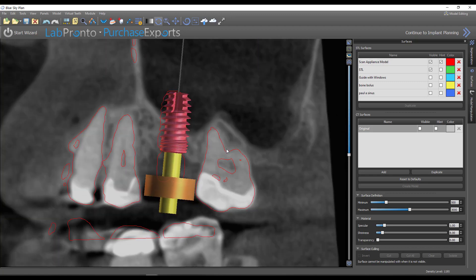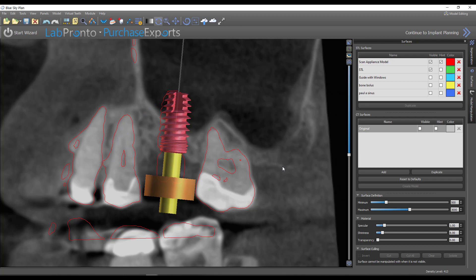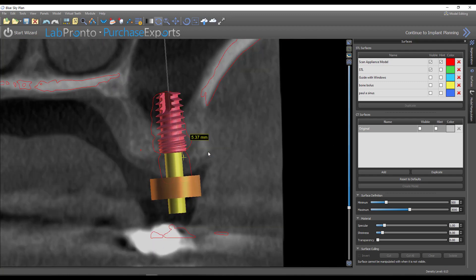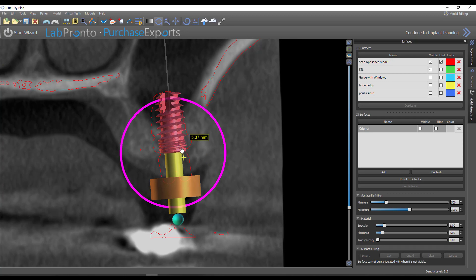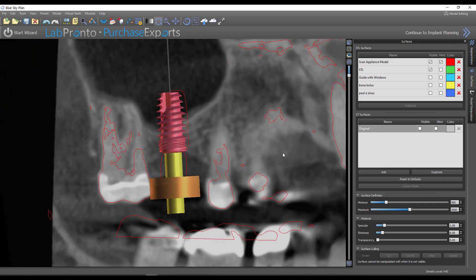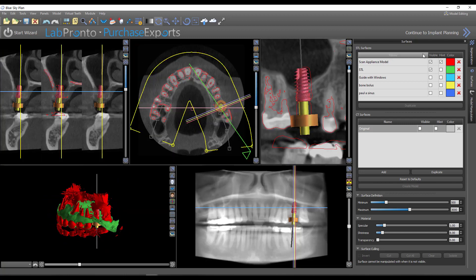So you can see depth is dead on. The positioning is a little bit towards the anterior by, you know, maybe half a millimeter. It's not even a full thread width. And you know, when you're doing these in a minimal amount of bone, it's always possible to lean on it one way or another and go slightly off course. But that's incredibly good. And then if we look at it from a mesial to distal view, you can see again that we are within the confines of that planned implant, maybe one or two degrees going more towards the nasal passages. But again, incredible amount of accuracy for the positioning of this implant. So that's how you would import the postoperative CT and compare the implant positions.